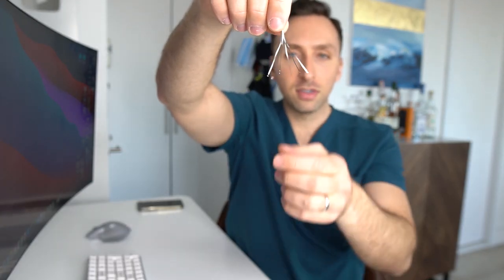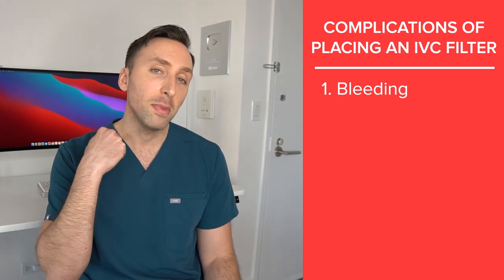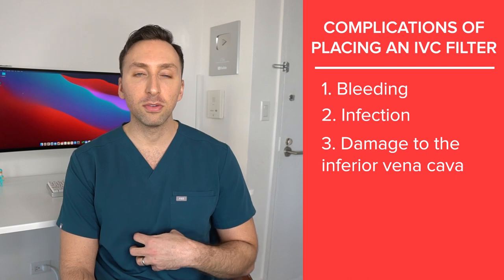Complications of placing an IVC filter: first and foremost, bleeding is always a risk, because we access the main vein in the neck — the internal jugular vein — or the femoral vein in the groin, and placing a larger sheath can always cause a bleeding complication. Another complication is infection, since this is a foreign body placed within the main vein of the body and the body doesn't necessarily love foreign objects. You could also have damage to the actual inferior vena cava from the filter's pointy tines, especially if left in for a very long period of time.